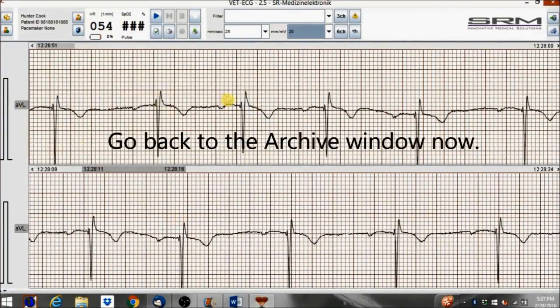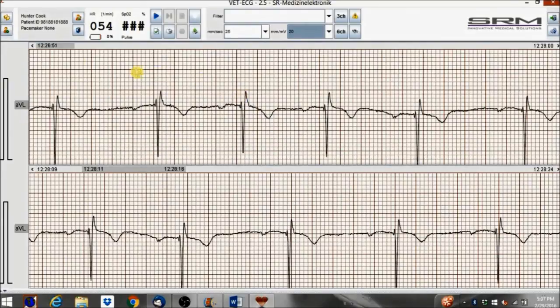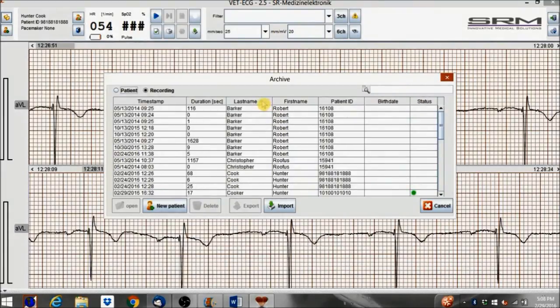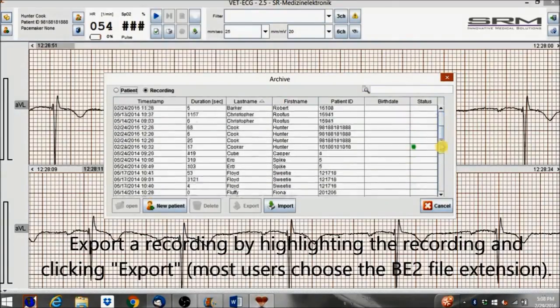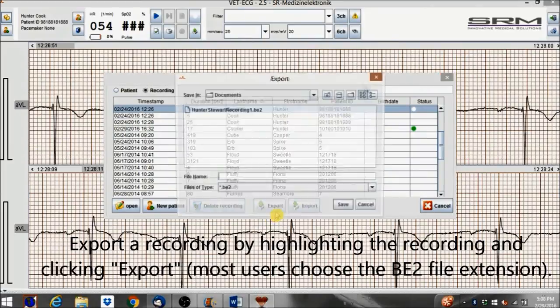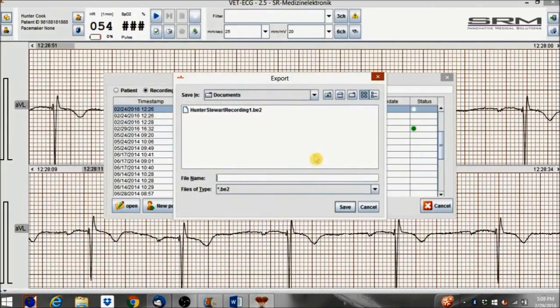Go back to the Archive window now. Sort by first name, last name, duration, patient ID, etc. by clicking the up-down arrows. Export a recording by highlighting the recording and clicking Export. Most users choose the BE2 file extension. Name the recording and then click Save.